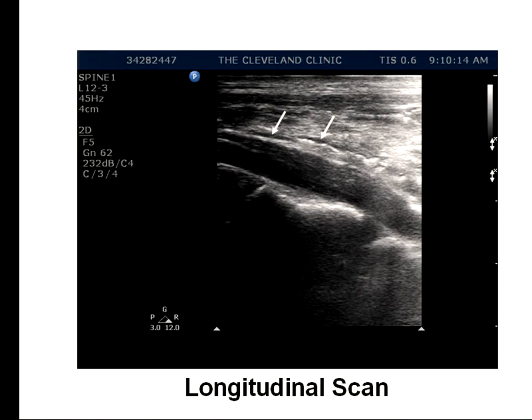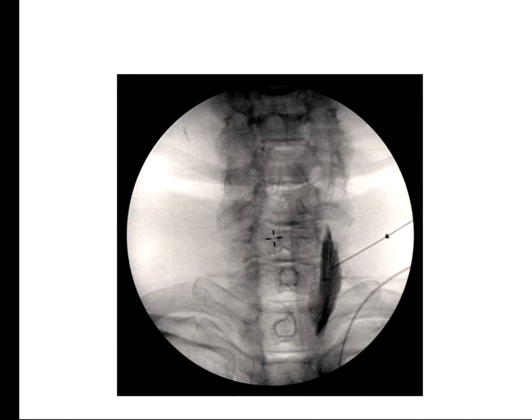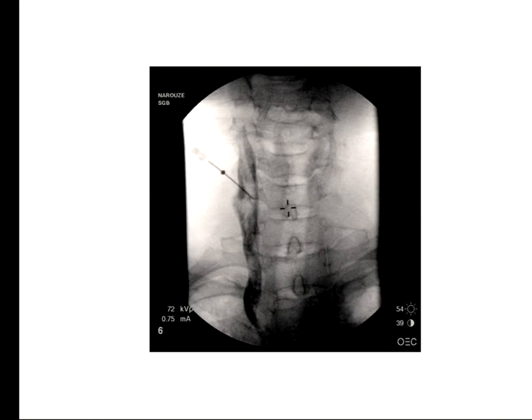How do I make sure? Sometimes, especially in the early training phase, I go with a long axis plane. So this is the vertebral bodies, discs in between them, long axis, the longus colli muscle, and you can see the medication. And this is the clavicle stopping me, going down even inside the chest cavity. We want to avoid this. This is a myogram. This is a contrast inside the muscle. We want to avoid this also.